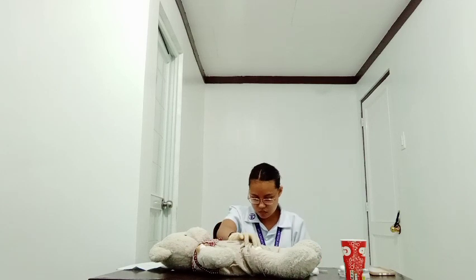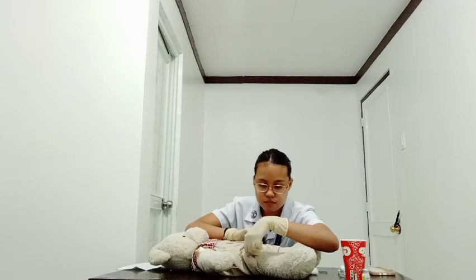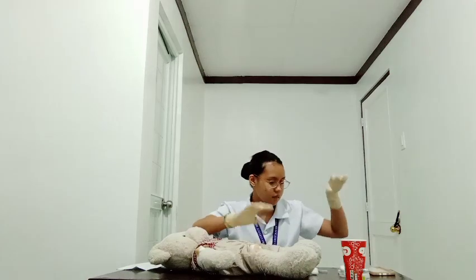Next, we need to dispose of supplies appropriately to protect the nurses and others from injury or contamination. For that, I'm placing this here, and then we'll crack the needle to prevent injury and dispose. Now, we need to assist the patient into a comfortable position. Flip down the medication ticket if not using MAR.